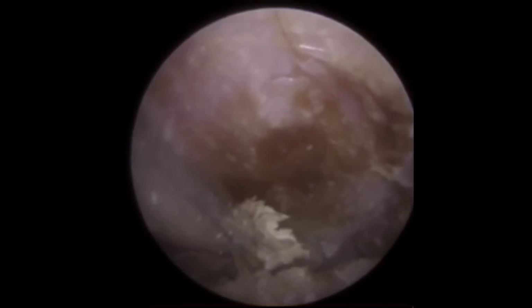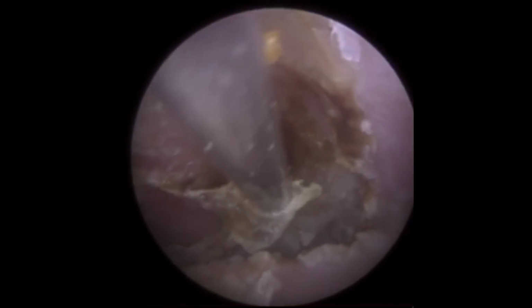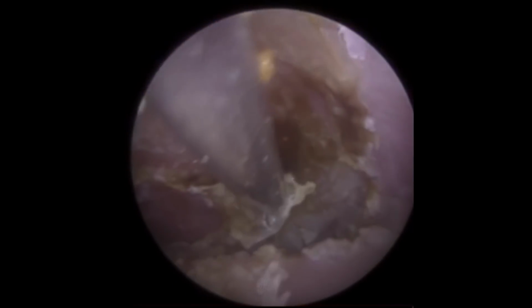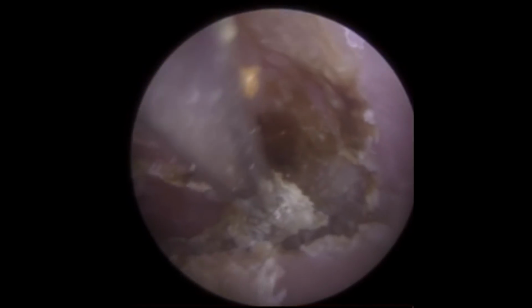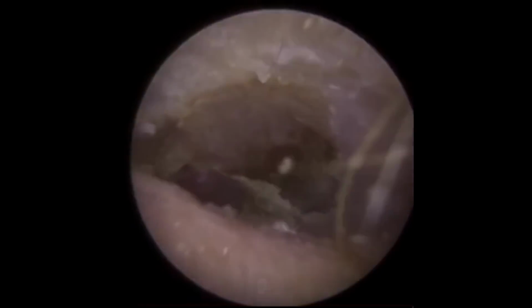So we're on the eardrum now, and if you've been watching my videos long enough, you would realise I really enjoy working very close to the eardrum. It's just that extra adrenaline rush, because you really do have to have a delicate, steady and gentle hand. And what we're trying to do is just peel this dead skin gently off the eardrum. Remember, the patient is awake. We haven't provided the patient with any local or general anaesthetic.